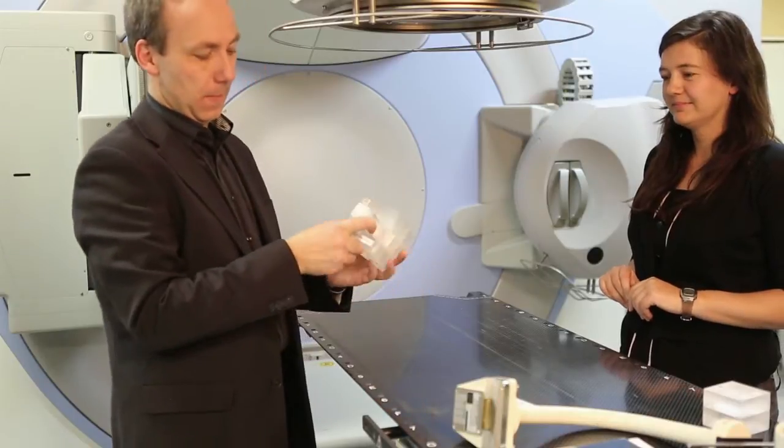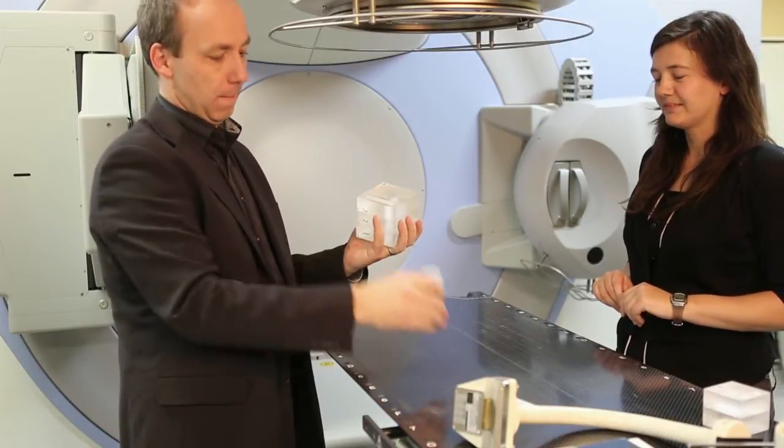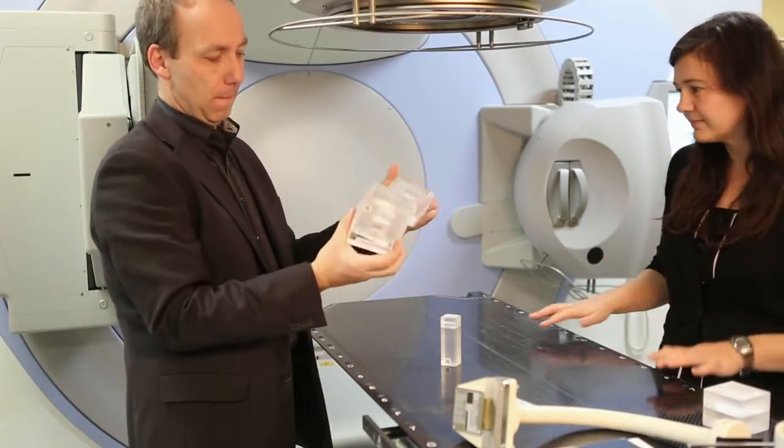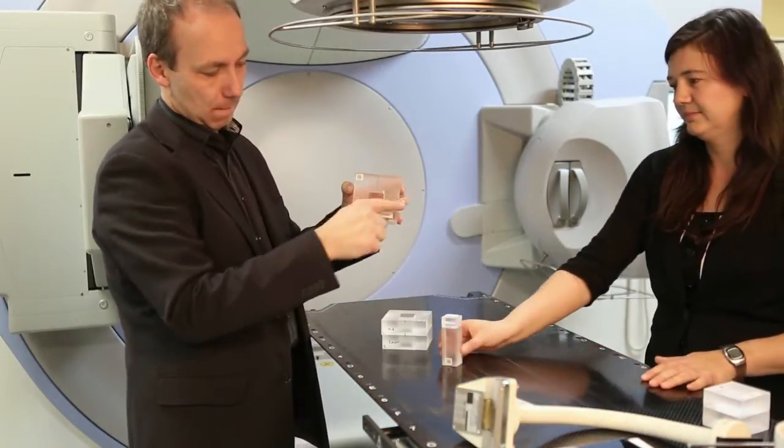The electron phantom comes in four pieces: the electron plug and three square rings. The rings are identical, except for the upper ring, which has lines inscribed for alignment with the crosshair.